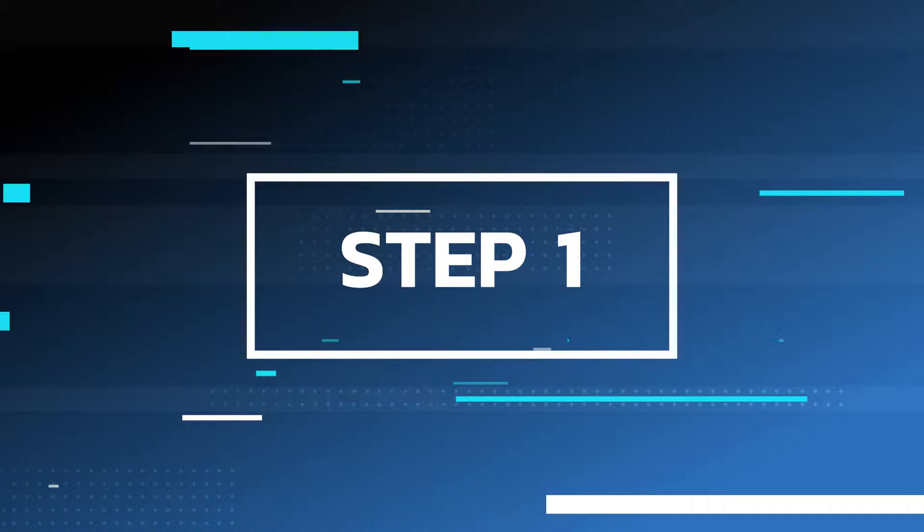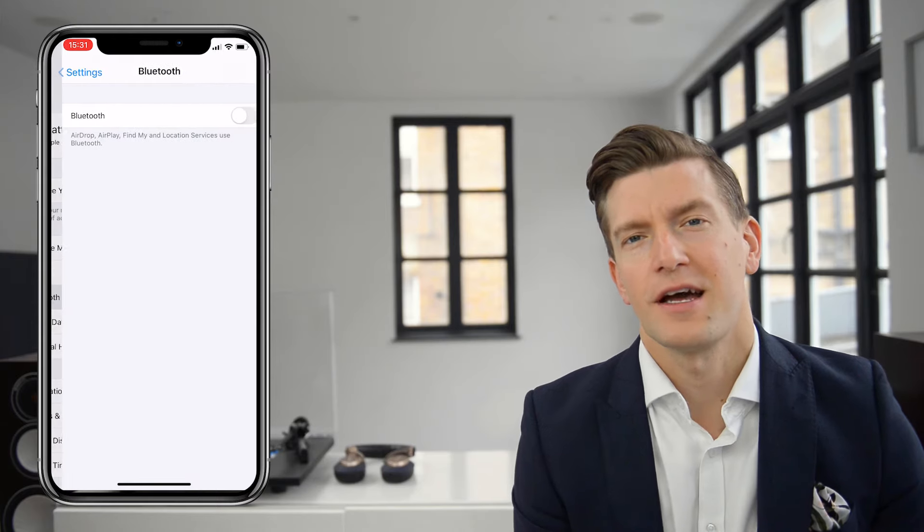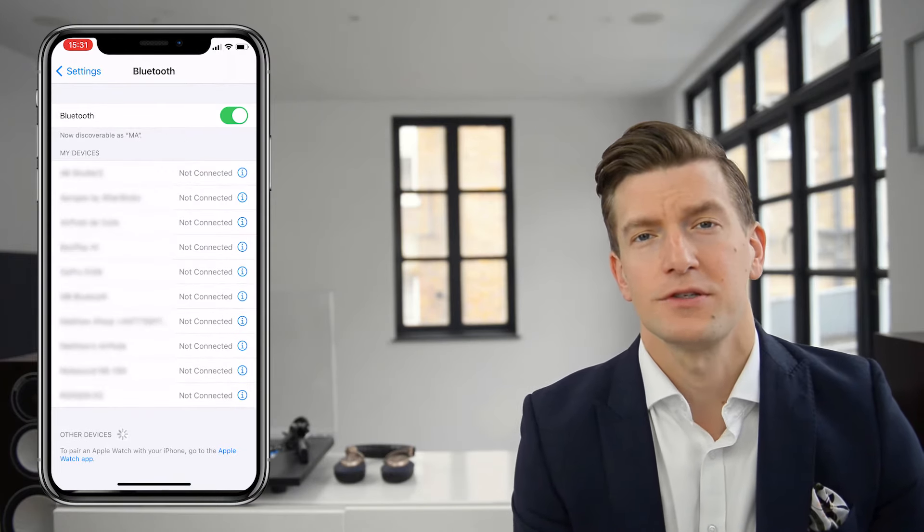The easiest way to show you how this works is to record my screen so you can see exactly which steps to take. Step one: open the Settings app on your iPhone, go down to Bluetooth, open that, and there should be a slider at the top. Slide it and make sure it's switched on and green.